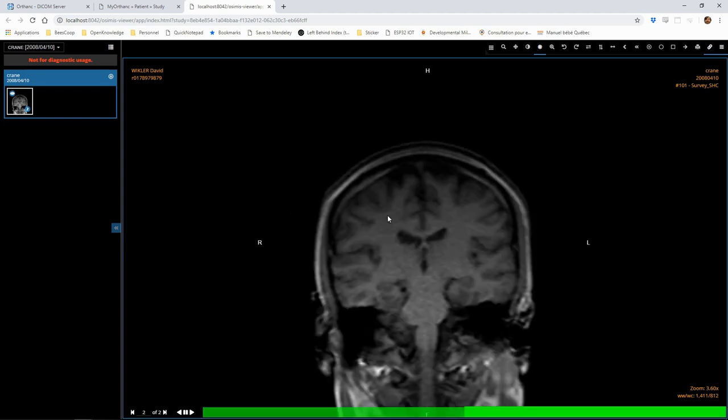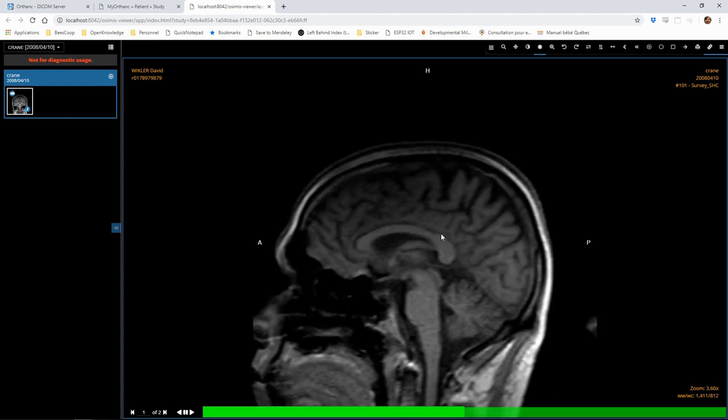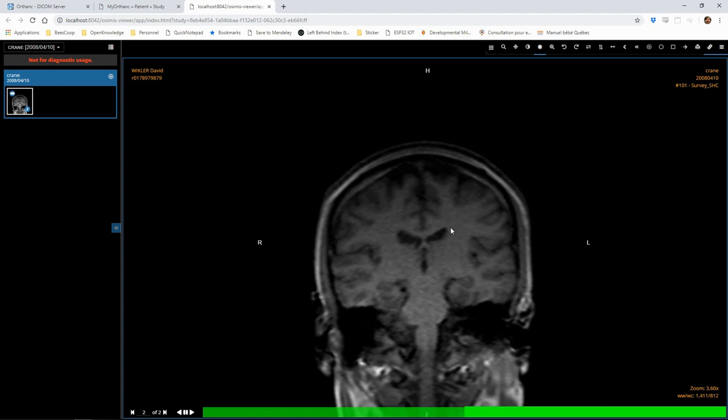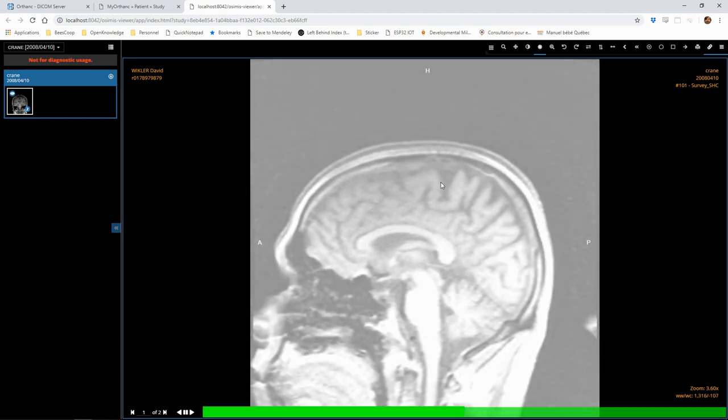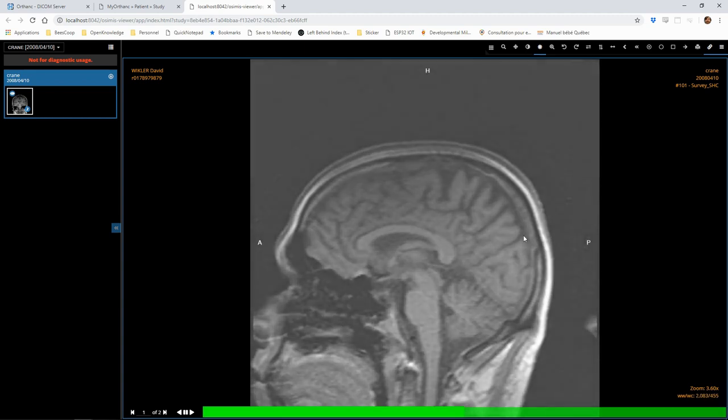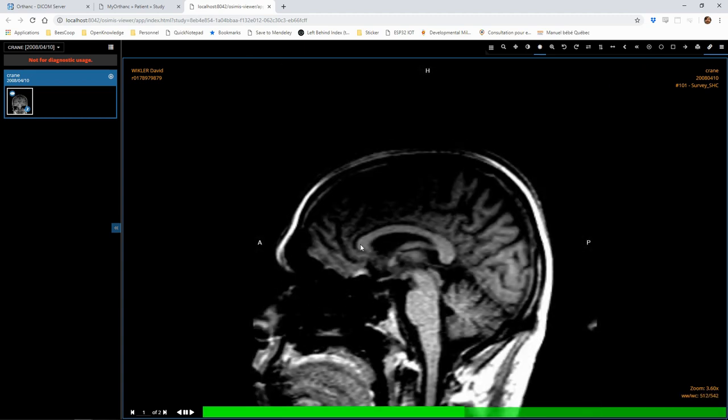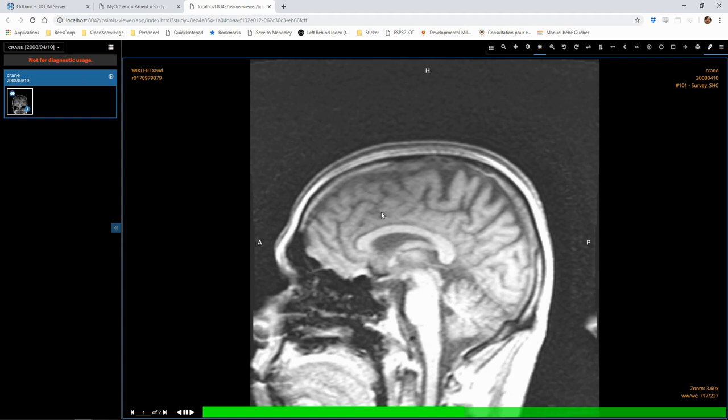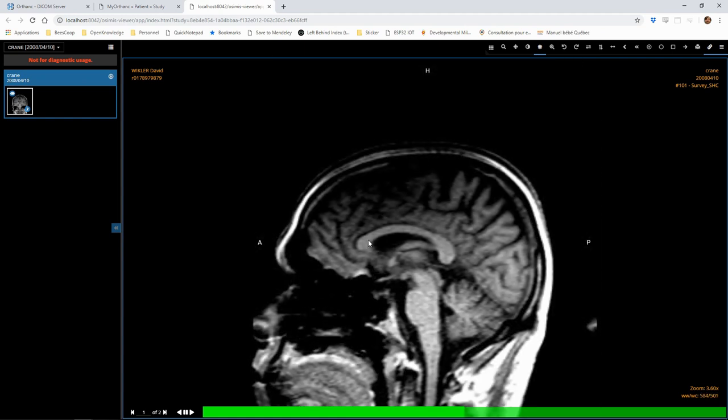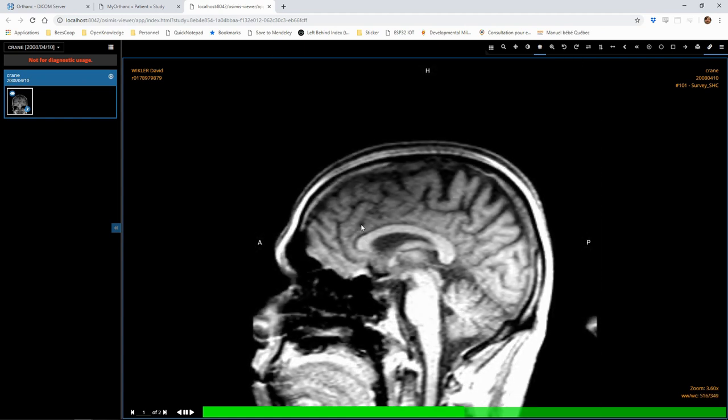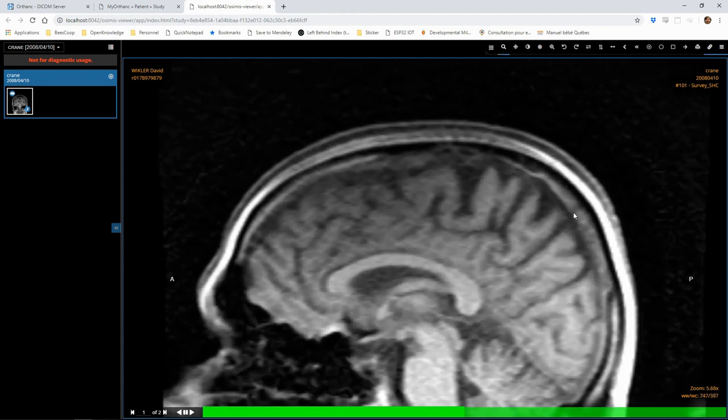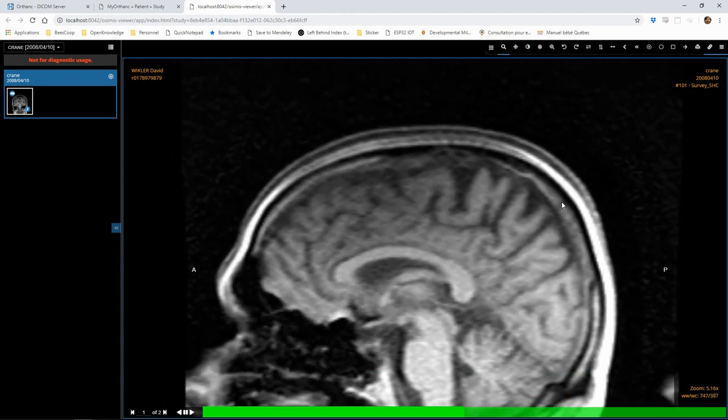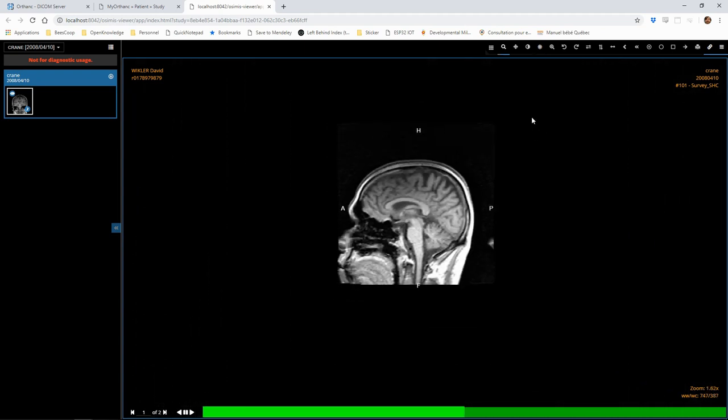In this viewer, we have some very basic operations such as changing the contrast or the luminosity. We can zoom into the image or pan.